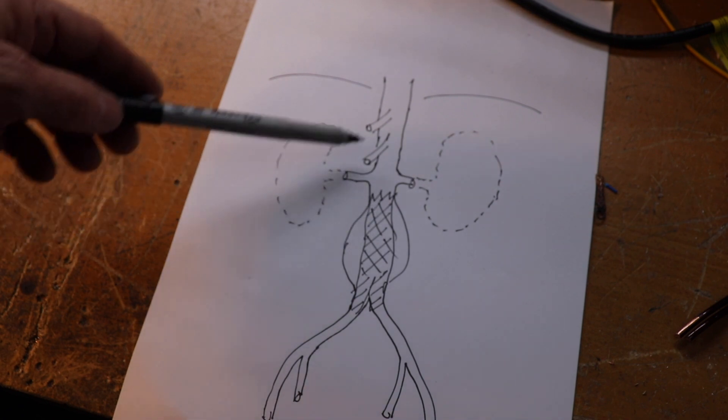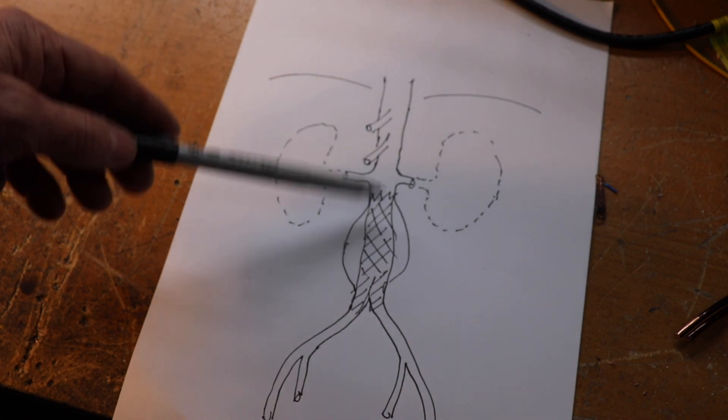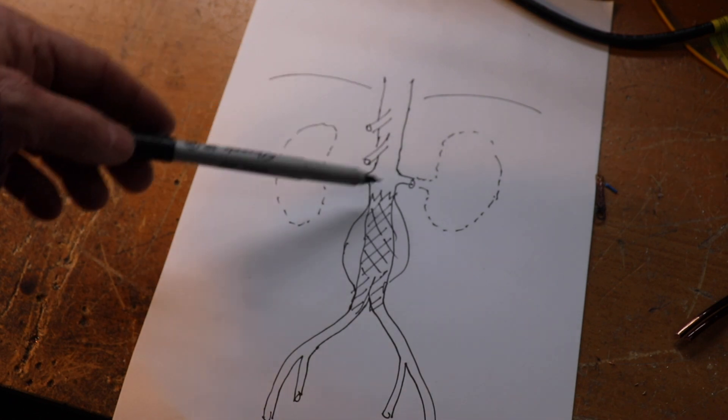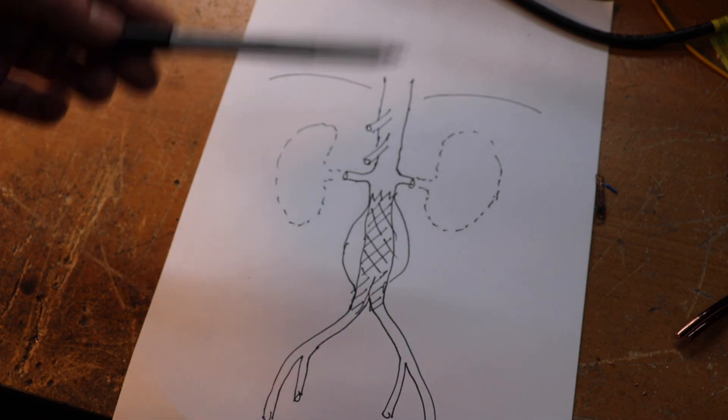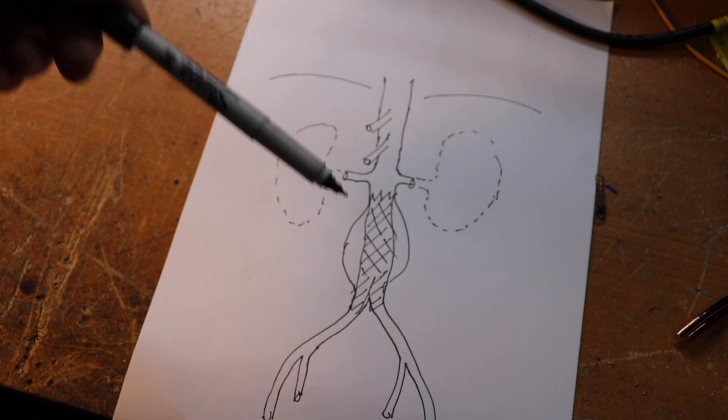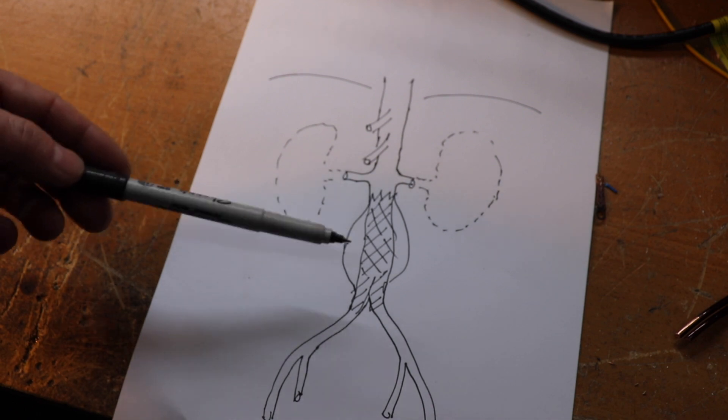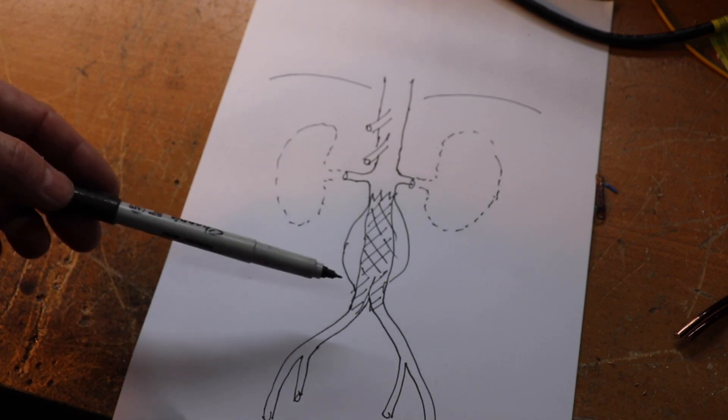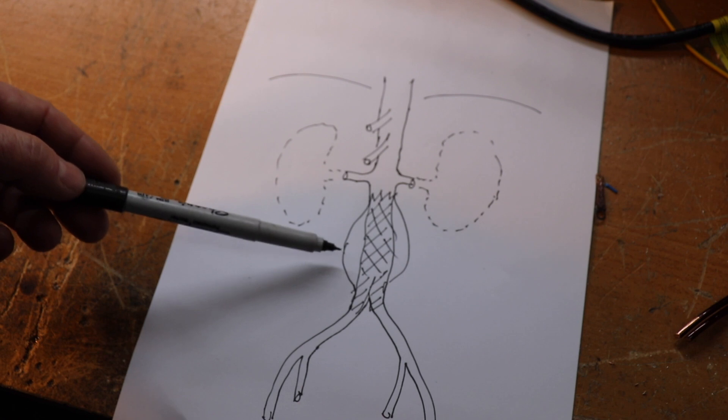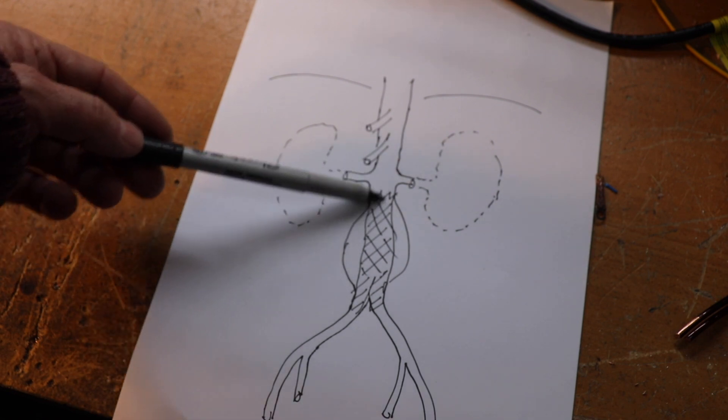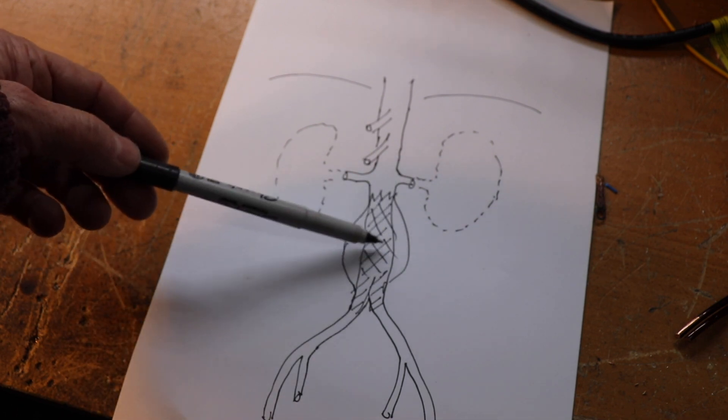Obviously if the seals fail, the aneurysm will be pressurized again. The open operation has stood the test of time, but it's a big operation. We have to clamp the aorta. There's lots of problems - it can strain the heart, there's risk of kidney failure, problems with the bowel. It certainly carries a higher morbidity and mortality. On the plus side, if you have an open operation that will usually last you for the rest of your life and you don't need the rigorous follow-up that you have with the stent graft.